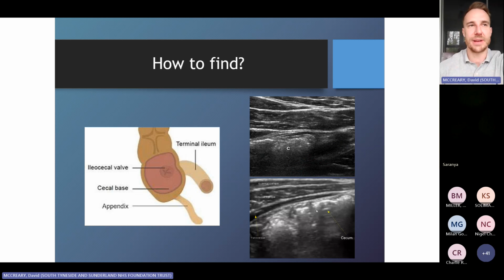Now, this all might sound a little bit complex, but I think what we've got to remember is that when we're seeing a child with pain in this region, if we're fairly convinced about an appendicitis, I can use data that we've recently accumulated to back this up: generally you'll find what you expect to find, okay? If it's a child where you're less convinced, you're looking around for maybe 5 to 10 minutes, it doesn't take that long, but you can spend lots of time talking to the child, having a really good look, graded compression, graded extra bits of pressure, and you may be searching for something that you probably know isn't going to be appendicitis. When it's fairly obvious and you think, right, I'm going to find something here, in my experience, it genuinely almost is every time, okay? So whilst it sounds a bit complex, it's not too complicated.